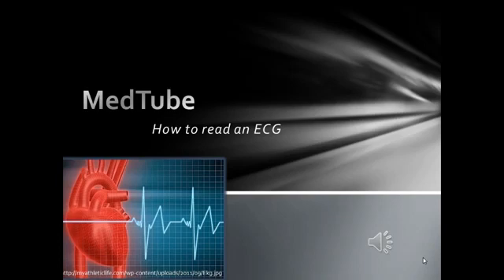But before we get started, I want to say that I'm not mentioning all the criteria for the different ECG abnormalities that we will be seeing, but I'm choosing the quickest and easiest criteria to understand and retain in order to apply them more quickly and efficiently during your rounds or in the ER.